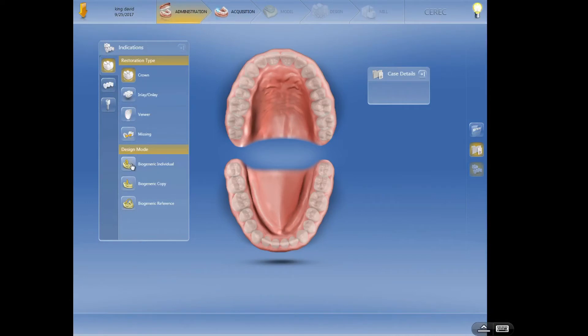This biogeneric individual is a great option from the standpoint of giving you really nice proposals. They've done a lot of good. Some of the earlier versions were a little wonky, very template-like. With bioindividual it really matches the anatomy really well.